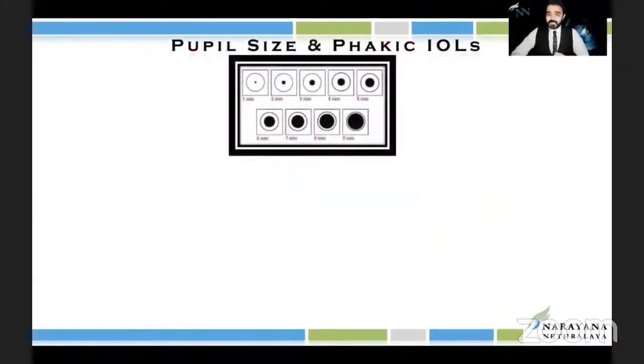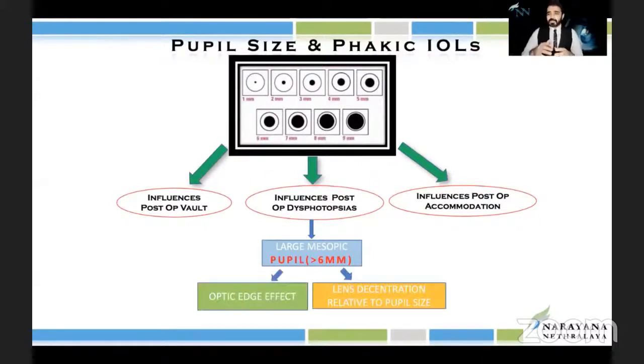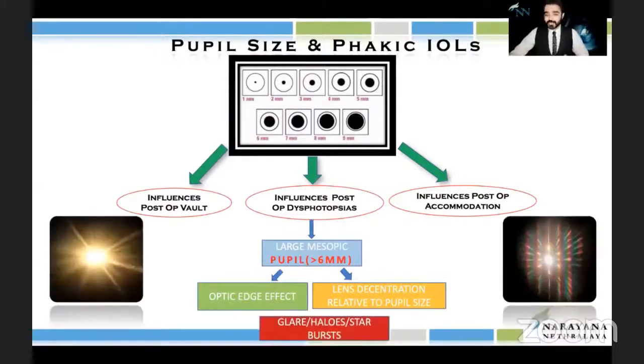Pupil size is something that normally all of us don't look at. Always look for pupil size, and if you have a mesopic pupil size more than 6 millimeters, better to avoid phakic IOLs. There are different companies which give you a larger optic size. They really customize to your needs, but generally, I think it's better to have a cutoff of mesopic pupil of more than 6 millimeters, because this can lead to a lot of halos and glare.